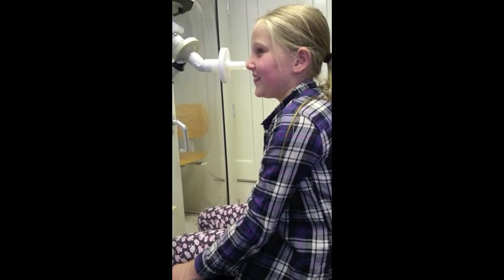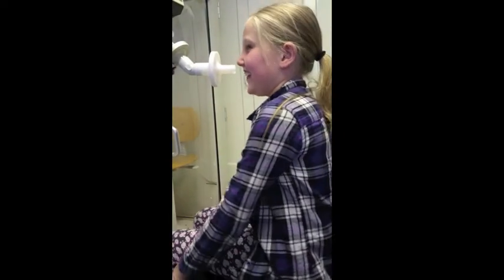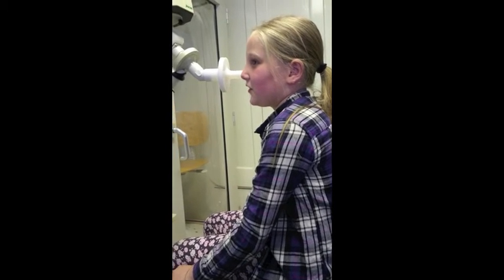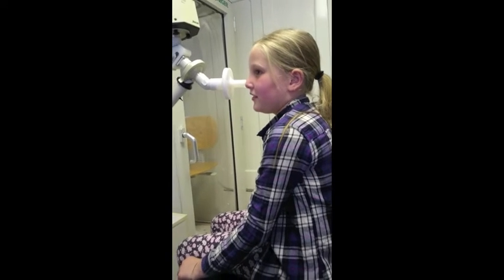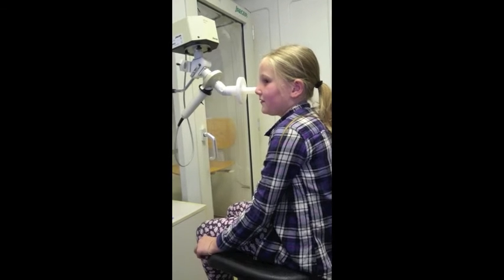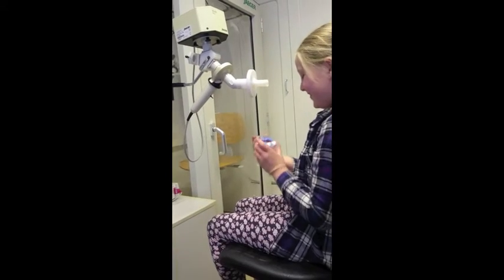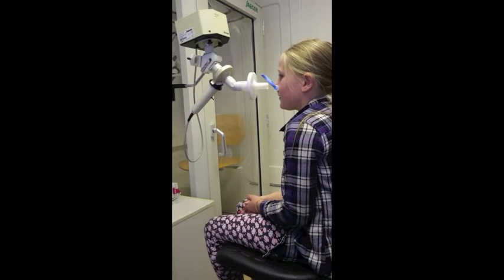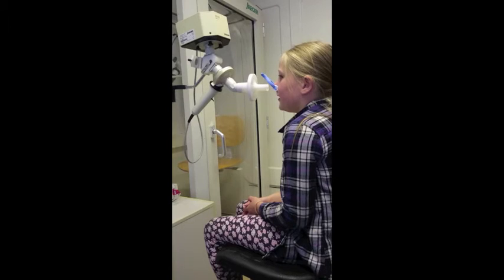Katherine is about to do the third test. For this one she has to take a really deep breath and then blow out as hard and as fast as she can. She has to keep blowing all of the air out of her lungs. This test is a bit harder than the other ones but Katherine gets to play games on the computer to help her blow hard. Vicky explains this test to Katherine and then encourages her to blow really hard.